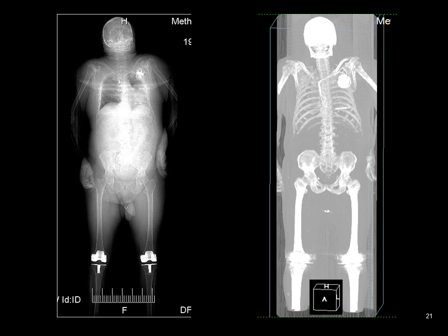And then we see something strange happening here and here. This is an example of scatter at the knees. You know what's happening here. Take a moment and see if you can interpret what's going on where I'm circling with the laser pointer.